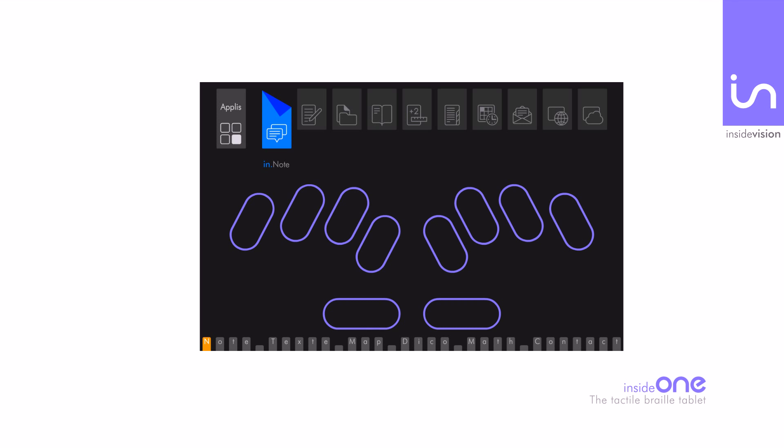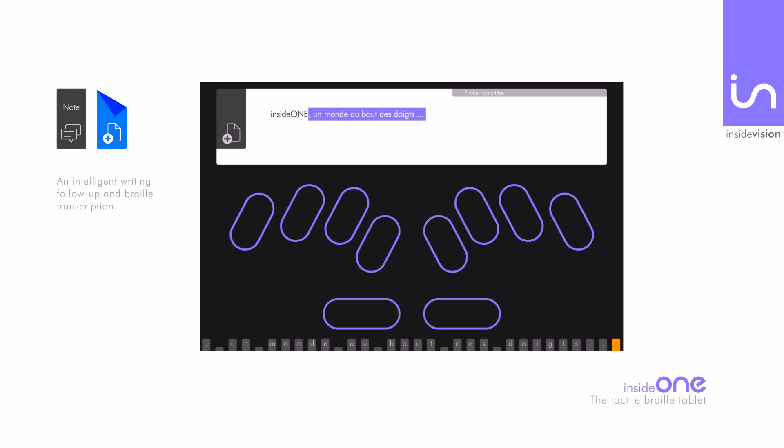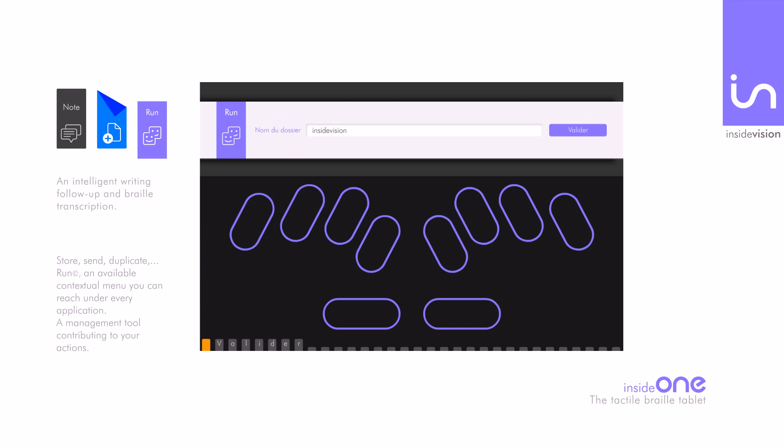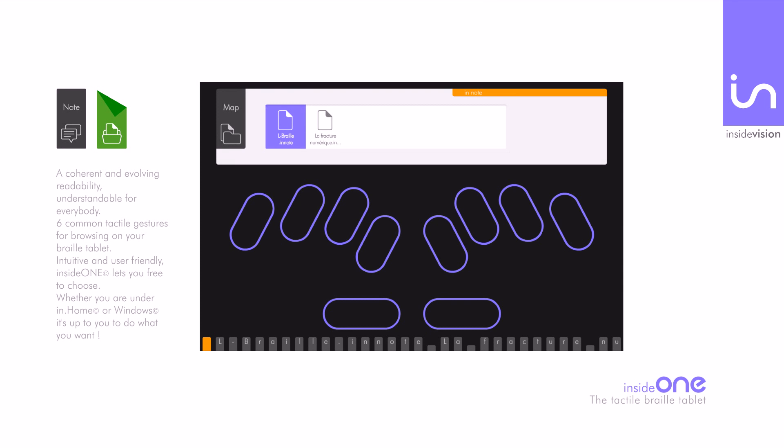Through the Note application, you can easily create a new document, open an existing one, or delete a document. Text is displayed in braille and vocalized, and an intelligent visual monitoring is available for sighted people. You can store, send, or duplicate your texts by selecting the Run menu, which is accessible and available in every application. InHome gives you an accurate and customized view understandable to everyone.